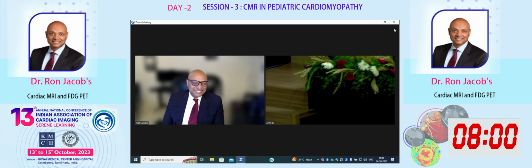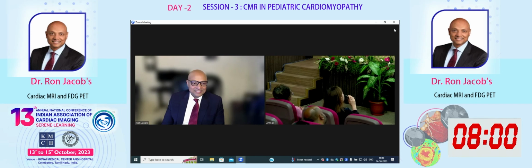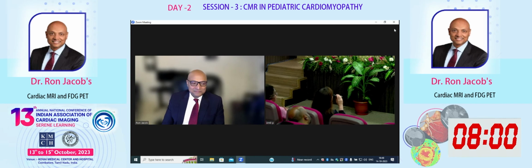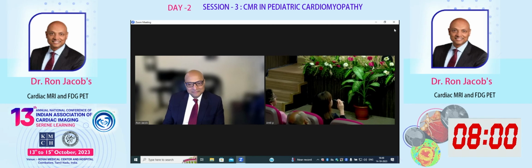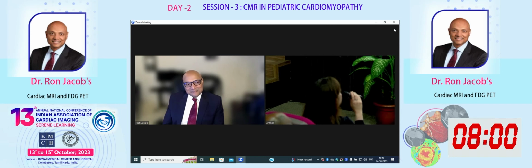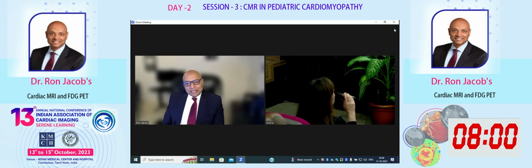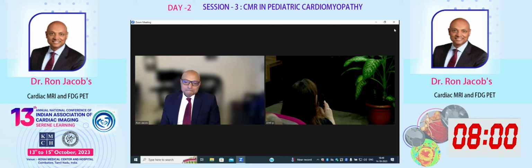Okay, great. I wanted to ask you, from the algorithm, it says if you suspect sarcoid and you have an abnormal CMR, you should then go to do the PET. Do you think the CMR is not good enough to just move on to treatment decisions, or is there something still not quite right about CMR in its current state for doing that?